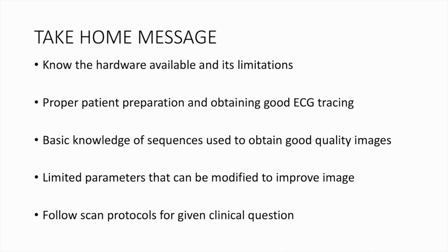To conclude, it is important to know the hardware available and its limitations. Do a proper patient preparation and obtain a good ECG tracing. A basic knowledge of sequences used will help in obtaining good quality images. And there are very limited parameters that can be modified to improve image quality by the technician or radiologist. And always follow scan protocols for a given clinical question to avoid unnecessarily prolonging scan duration.